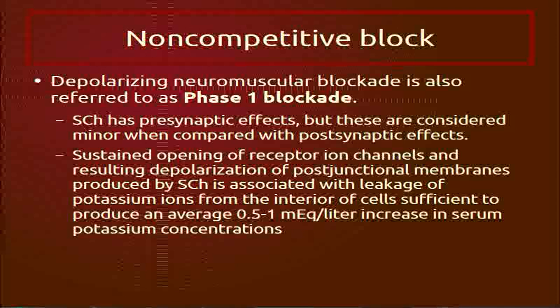Anybody here ever seen someone with sux and then they had the train of 4 monitor turned on? It's different than the non-depolarizers, right? We talk about this thing called fade with the non-depolarizer, and we know that fade means that the non-depolarizer is causing a condition in which there's less presynaptic release of vesicles and less calcium, and so our muscle contraction gets weaker. That's called fade. It fades away.